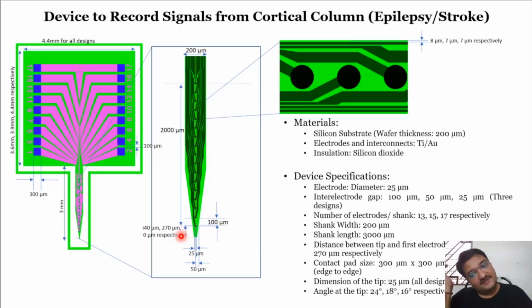Things are placed when you go intracranially, or inside your brain. Already there are a lot of nerves, and there is a very small gap, a few millimeters, like 2 millimeters, 4 millimeters, not more than that, between the nerves which are going. Even a small incision or a small damage to that nerve, as I mentioned, can result in lifelong disabilities. So the free space inside your brain is very small.